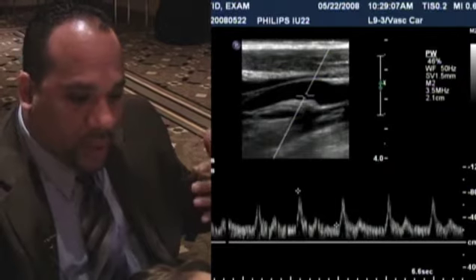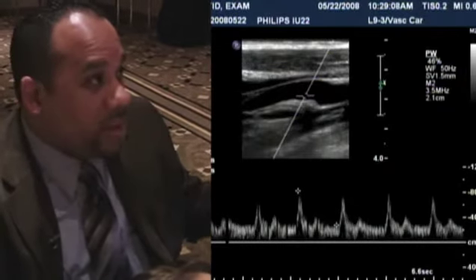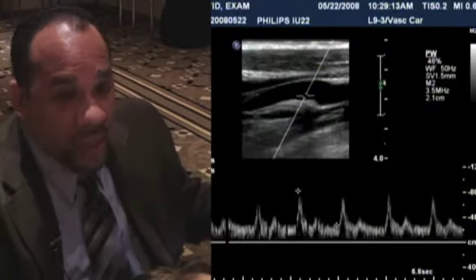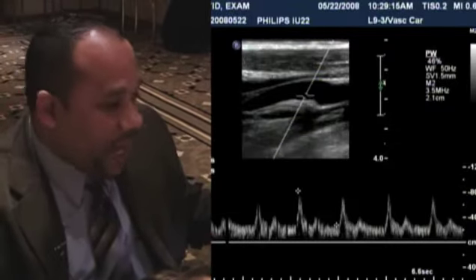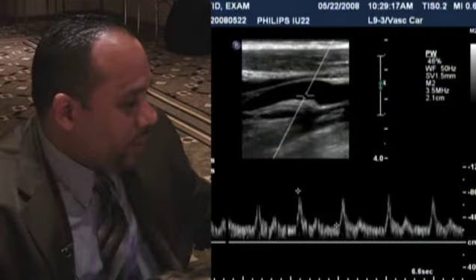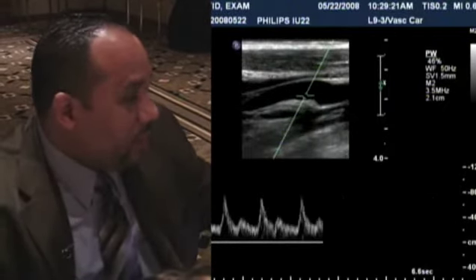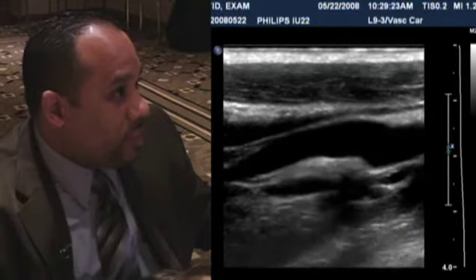And again, you'll be documenting all of this. In some cases, the machine will do it for you. You may be acquiring hard copy images. You may have a PAC system. But all this information should be documented and then provided to the interpreting physician for his interpretation.